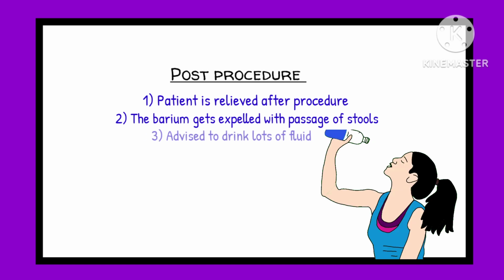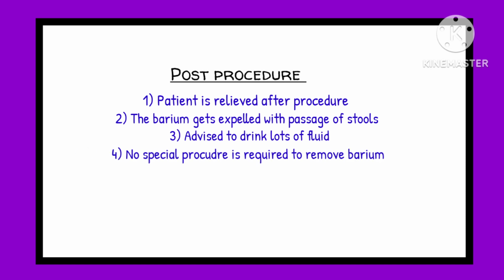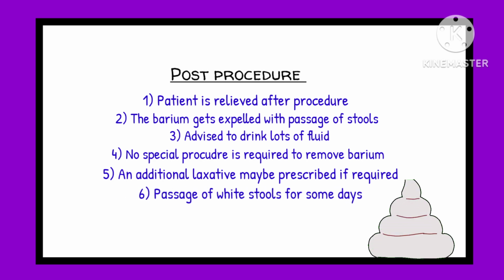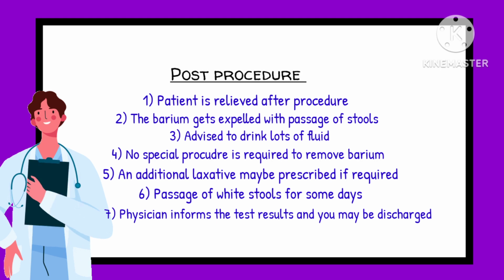Patients are usually advised to drink lots of fluid as barium has a tendency to cause constipation. No special procedure is required to remove the barium from the intestine, but when required, an additional laxative may be ordered by the physician to aid in its excretion. The patient may pass white stools for a few days after the procedure. The physician or radiologist will inform the test results to the patient, and the patient is then sent home.